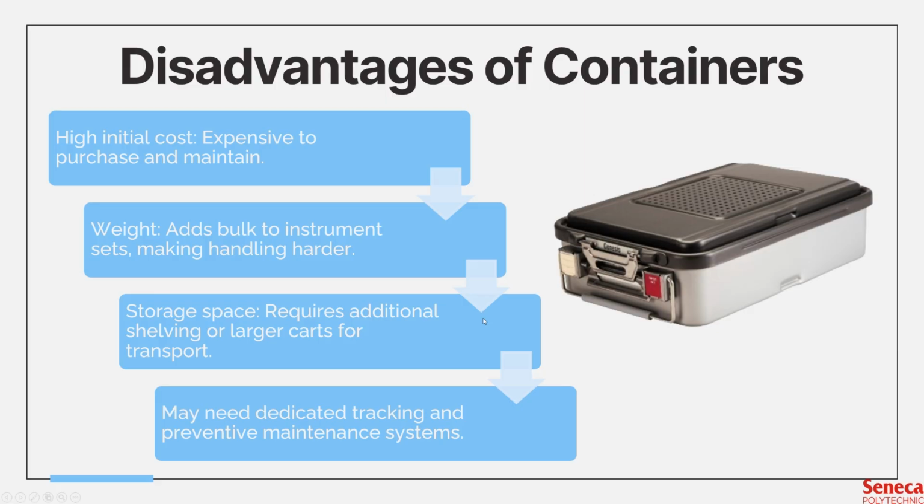Of course, there are disadvantages to containers too. Although containers have many advantages, the limitations are there. They're heavier than wrapped sets, which can increase strain for technicians if not lifted properly. The initial purchase cost is higher, though offset by reusability.